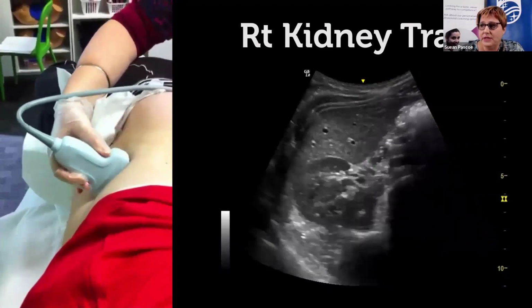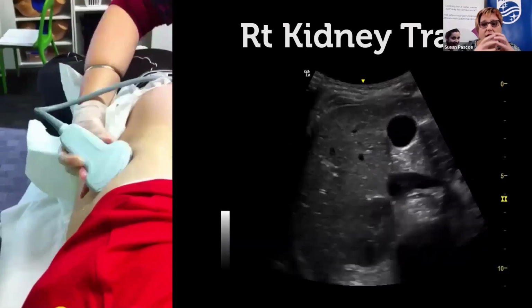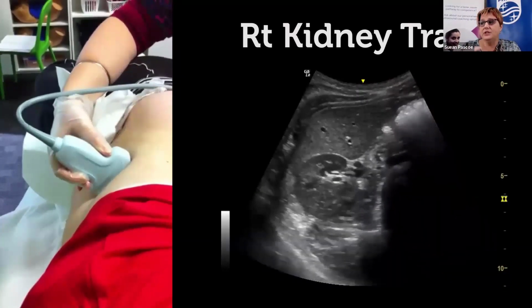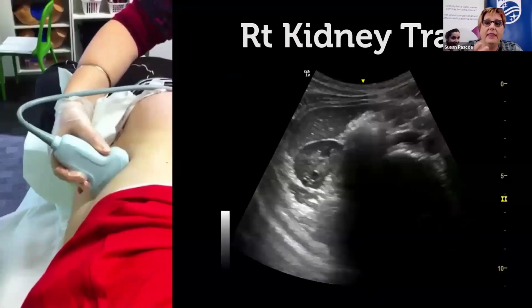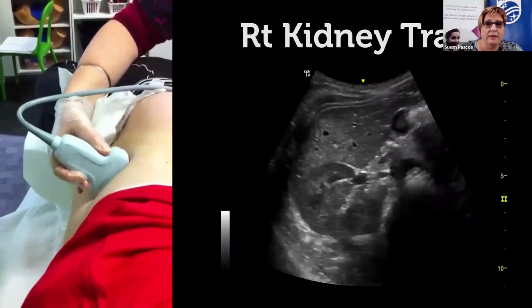And as you can see, as we sweep through here, at the upper pole, it will be a round shape where you can see the cortex of the kidney sort of making a circle. As you come through the middle portion, the cortex of the kidney will make that C shape around the hilum. And then at the lower pole, again, it will come down to make a round shape.